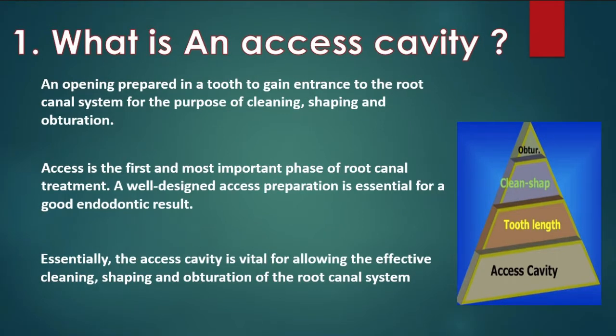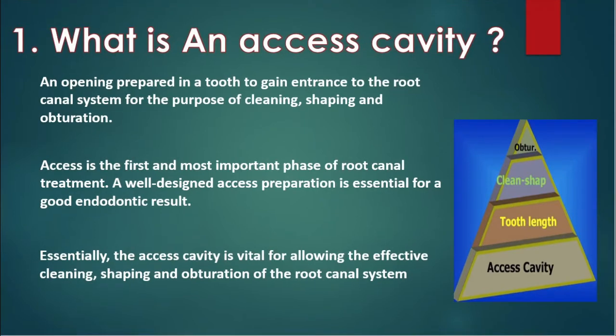As I mentioned earlier, having a proper, well-designed access cavity preparation will allow you to achieve good cleaning, shaping, and obturation of the root canal complex. As a result, we can consider the access cavity preparation as the most important phase of the root canal treatment.